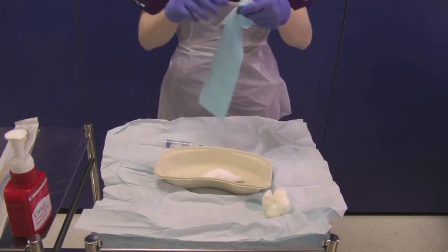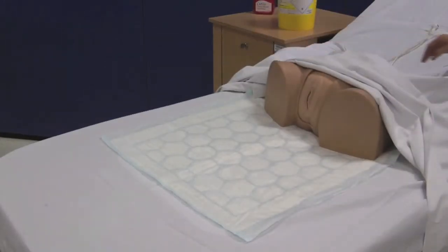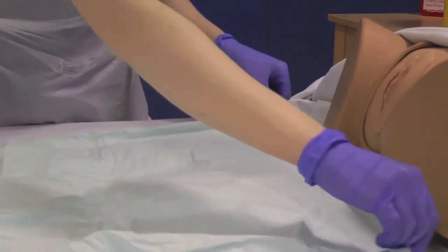Open out the sterile drape. Ask your assistant to expose the patient. Note the presence of the Inco pad to prevent soiling of the bed sheets. If the patient is able to, ask them to assume the lithotomy position. Take the sterile field from the catheter pack and place under the patient.